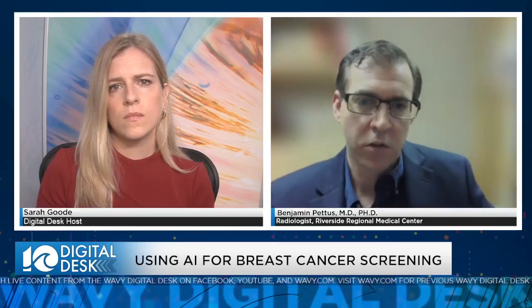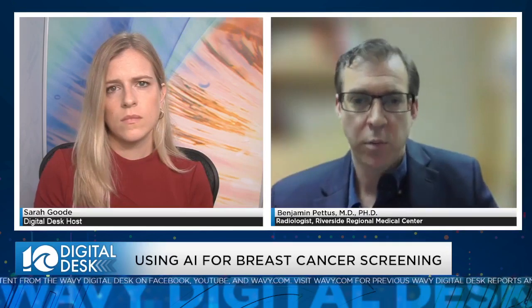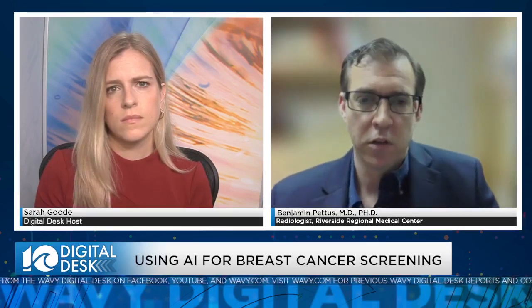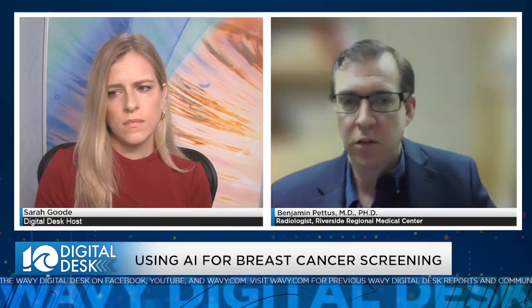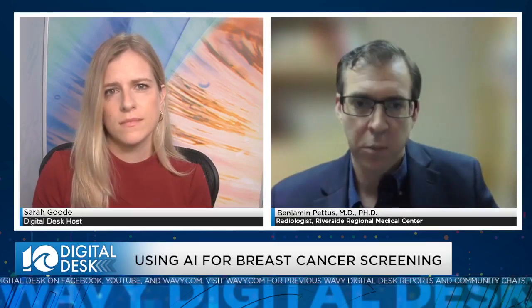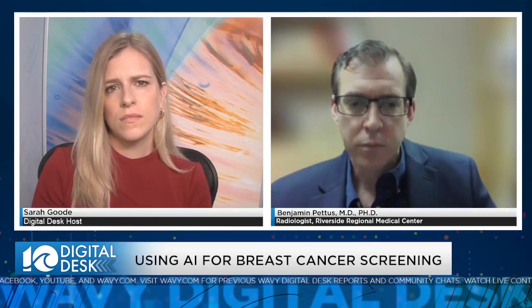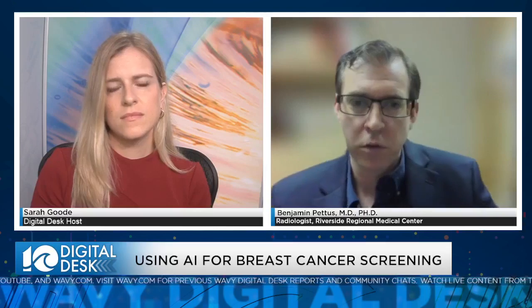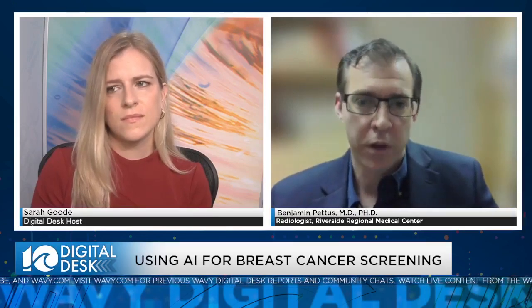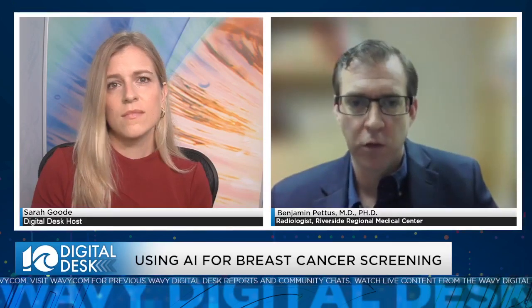So it's not making the decisions. The doctor still has to do all the work we've done in the past. We still have to make the decisions, but it functionally creates a safety check for the patients because, again, it's a second set of eyes. It's a way to make sure that all of that has been evaluated, and that if there's anything of concern, the odds it's going to be detected should be a lot higher. So there are some things about AI that could be potentially scary to patients, to viewers, depending on how things are used. But in our situation, it really shouldn't be a concern like that.